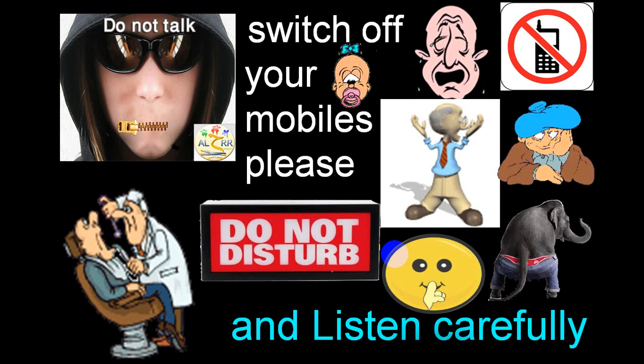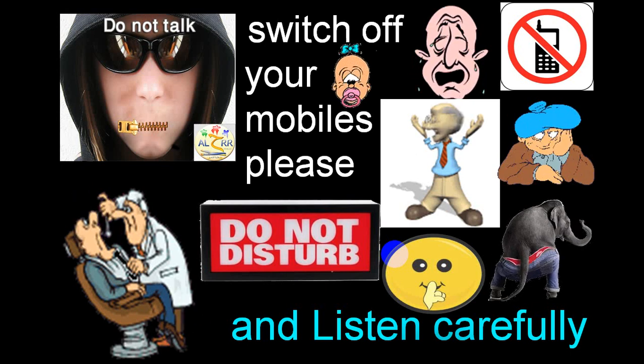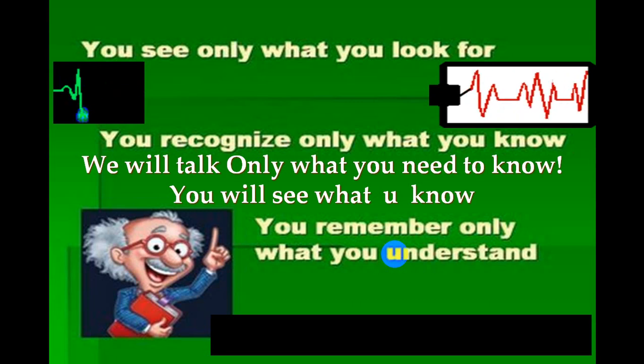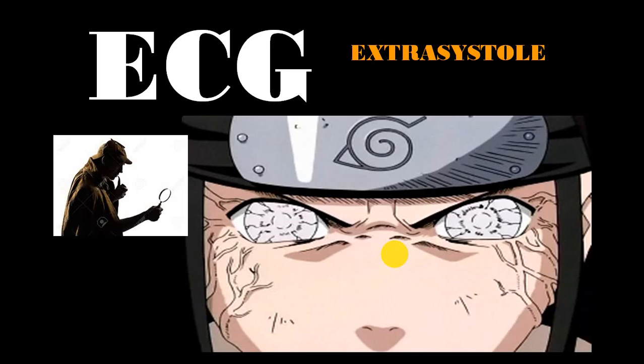Already we have given a little idea regarding extrasystole in a previous lecture, but today we are going to deal with those extrasystoles in a little more detailed explanation. Again, you will see only what you look for, you will recognize only what you know, and you will remember only what you understand. So I'll try to make it as simple as possible. So today's topic is extrasystole.